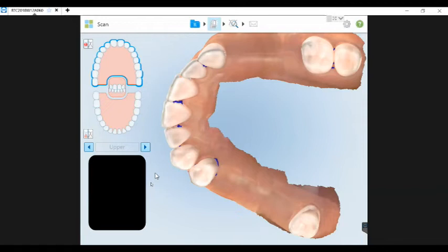I'm not sure if it's a question. Maybe they're wondering if we have any scanning tips for someone being seated for brand new dentures instead of previous. So, new denture scanning tips. Patients who have never worn a denture, or maybe they've lost their old denture.